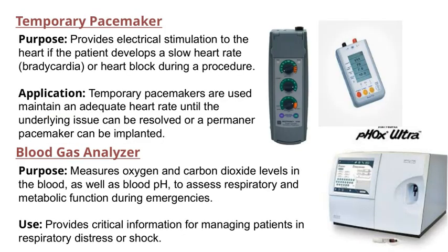Now, let's take a closer look at the temporary pacemaker. Its main purpose is to provide electrical stimulation to the heart when a patient develops a slow heart rate, known as bradycardia, or if there's a heart block occurring during a procedure. Essentially, it acts as a temporary backup to keep the heart beating properly until the underlying problem can be addressed.